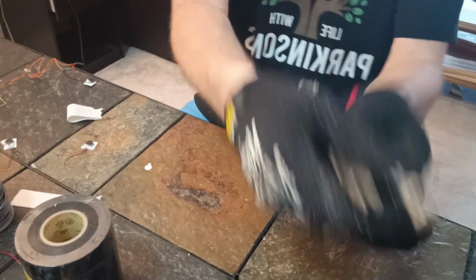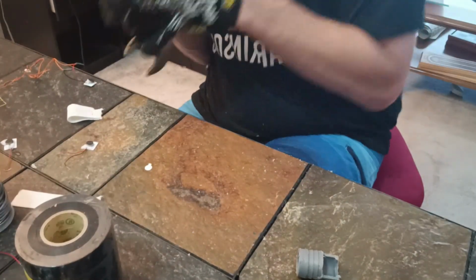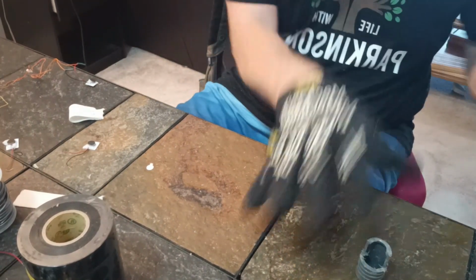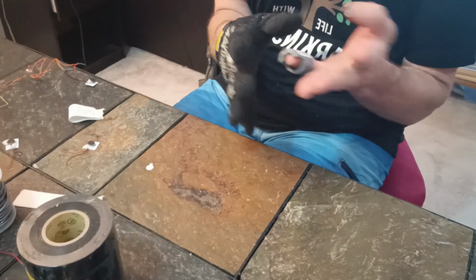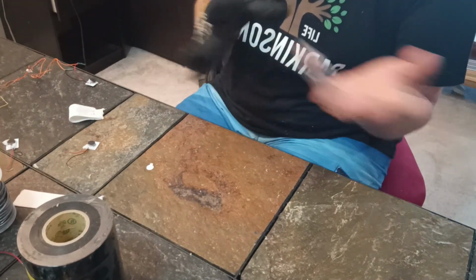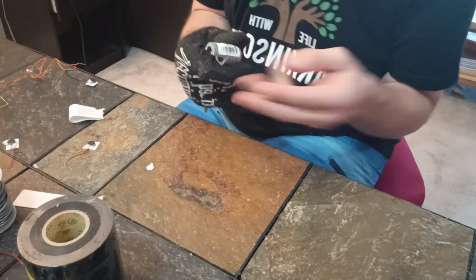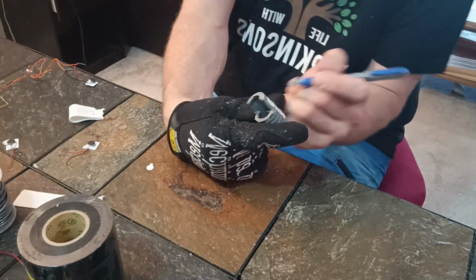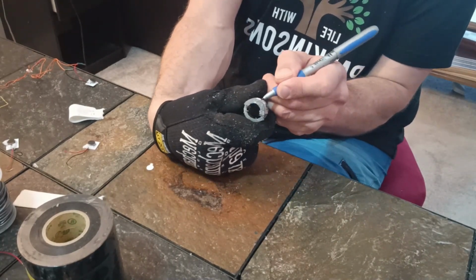Now to mark it, I'm just going to imagine my finger was in there. Yeah, right about here. So I want to drill.